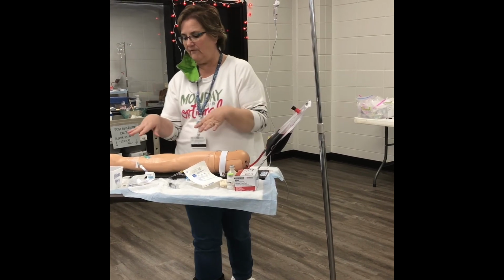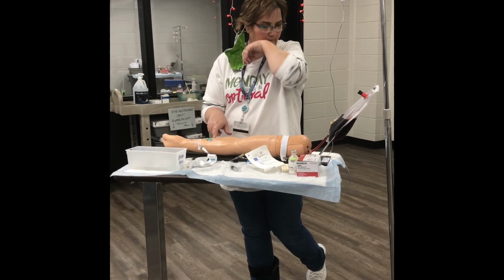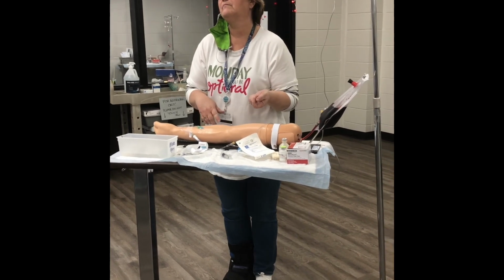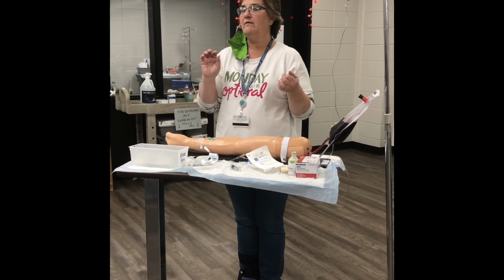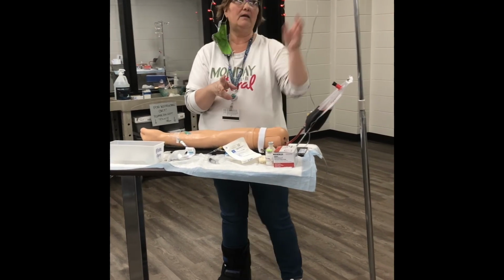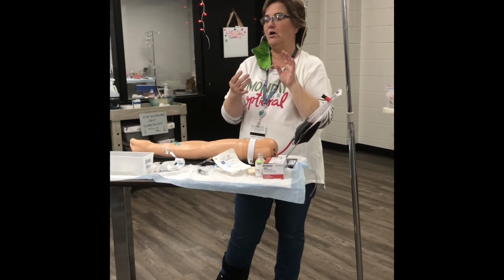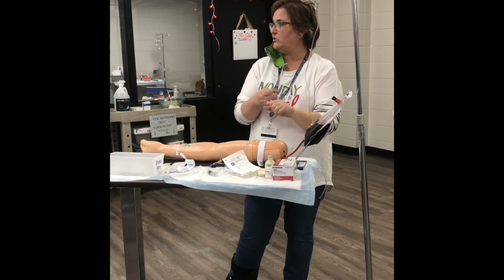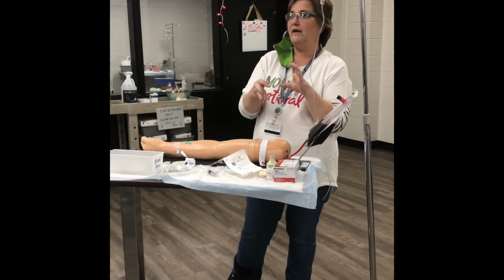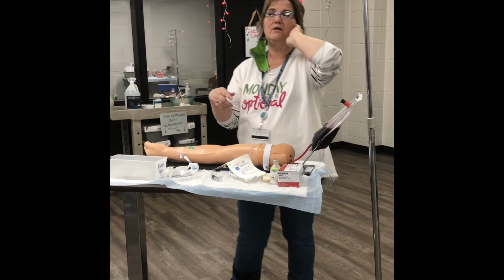We have started our IV fluids, and to chart that, you would put: 22 gauge 1 inch IV catheter initiated to left forearm, blood return noted, flushed with 1 milliliter of normal saline without swelling or complaining of pain at the site, and then normal saline initiated at 32 drops per minute. So you have to chart what size catheter you used, what site you used, that you got blood return before you flushed it, that you flushed it to make sure the site was good, and then the fluids you started and how fast they're going, or what their rate was.